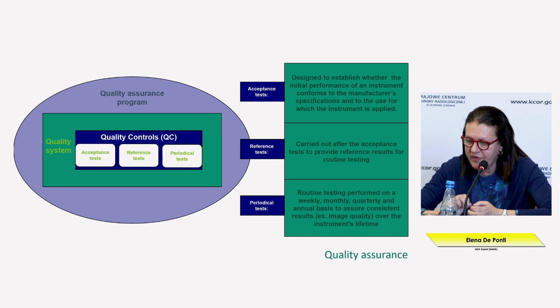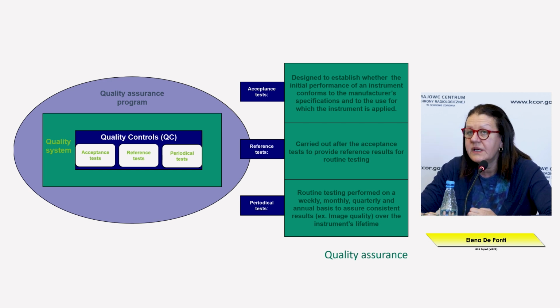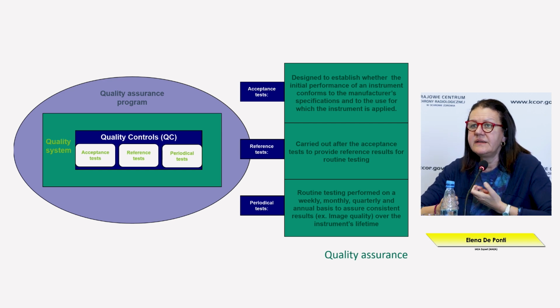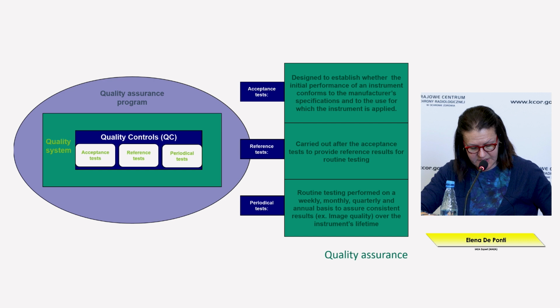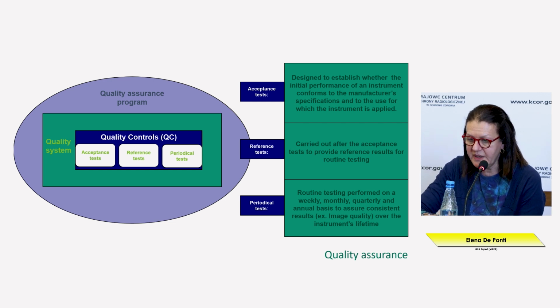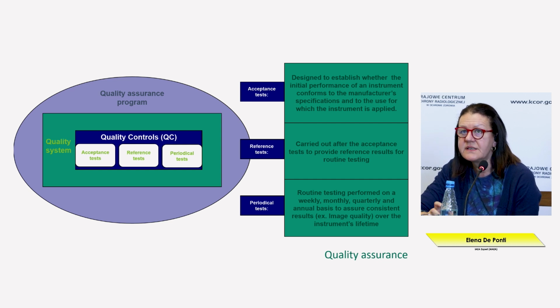We have to provide, from the first step to the final step, that is the report that the patient brings to his referring physician, everything organized in the proper way. So we have to consider all the aspects that can influence the final result.